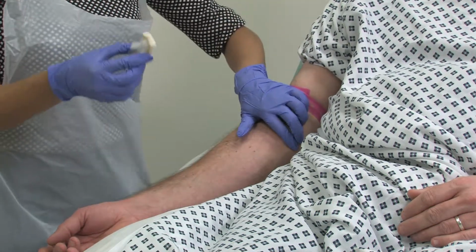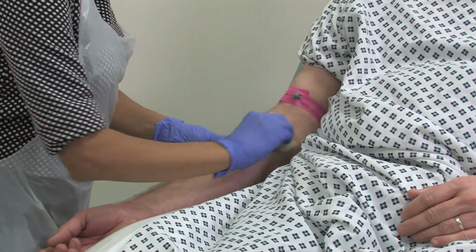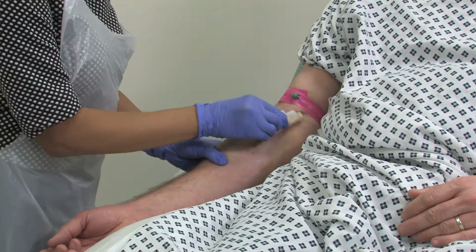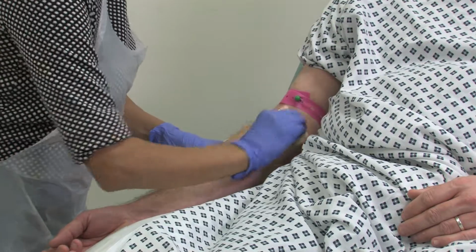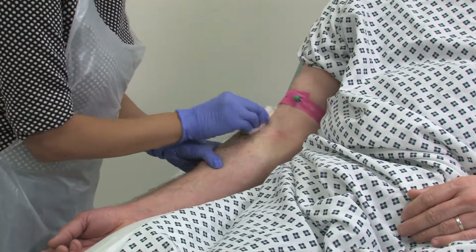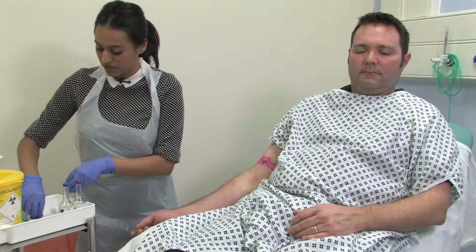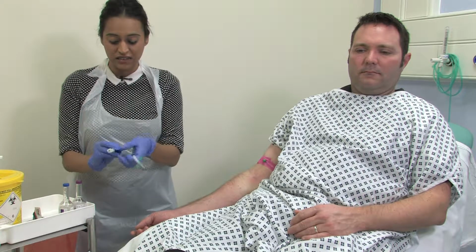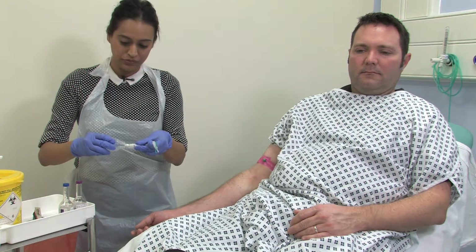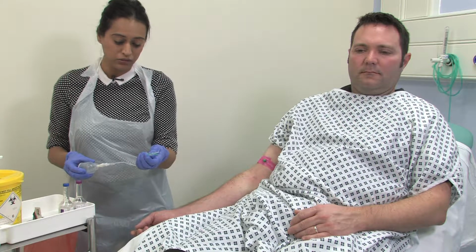Once a suitable vein has been identified, we can clean this area using the chlorhexidine applicator. It's important when we're doing this that we use up and down and back and forth strokes, and we do this for 30 seconds. Whilst the skin dries, it's important that we set up our butterfly set with our adapter cap. We are now ready to collect our blood cultures.